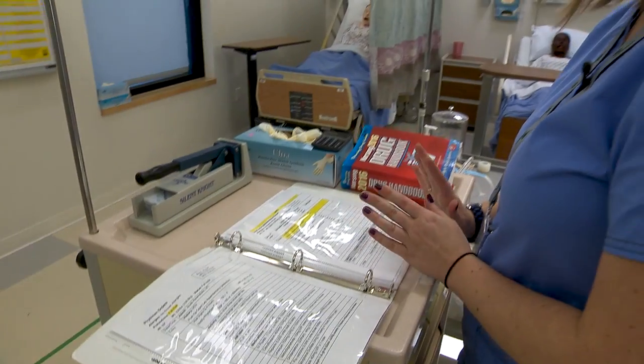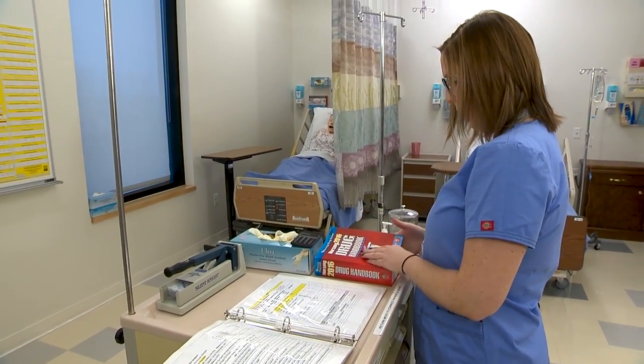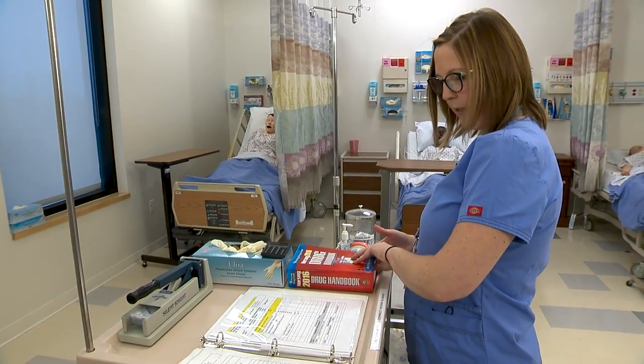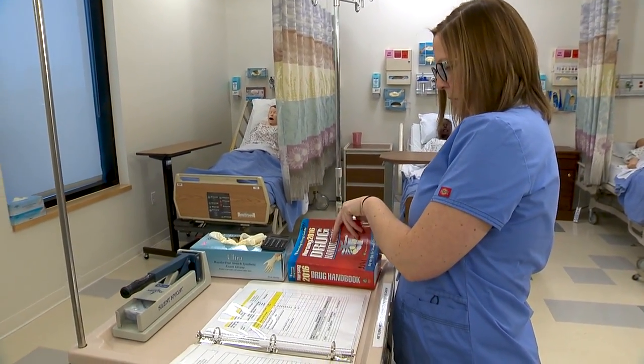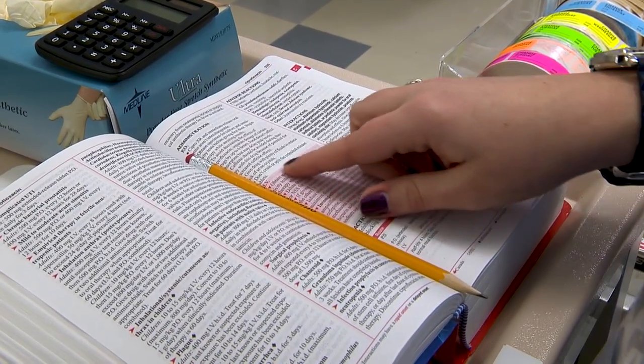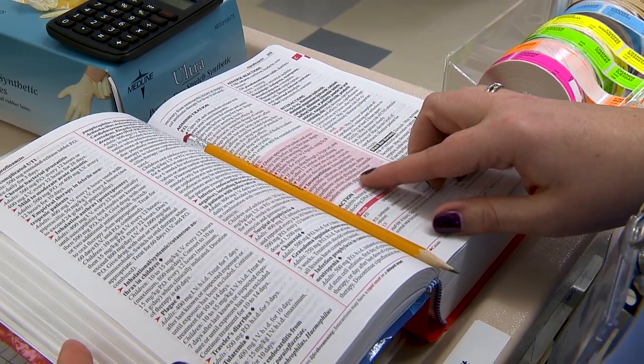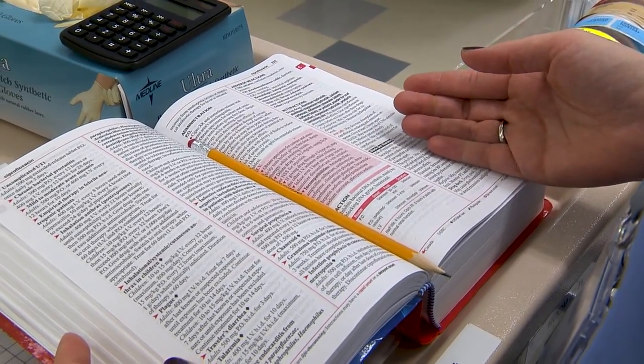Now I need to check for compatibility because it looks like he has IV fluids running as well. So I want to make sure that my antibiotics and IV fluids are compatible. So I'm going to look in the drug book here. I see here it doesn't look like it's incompatible with 0.9 normal saline, so we're good to go.